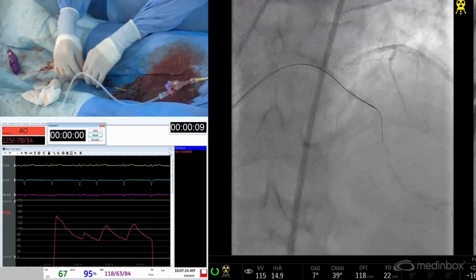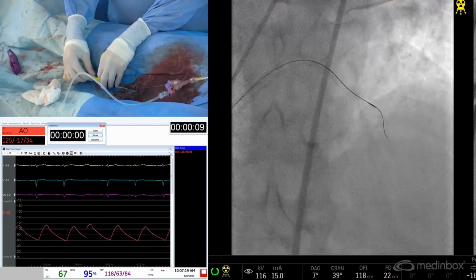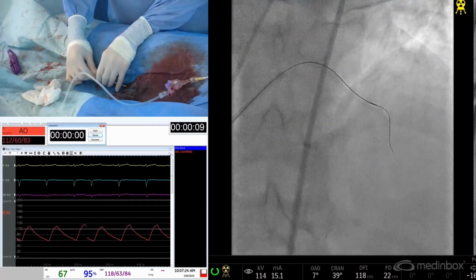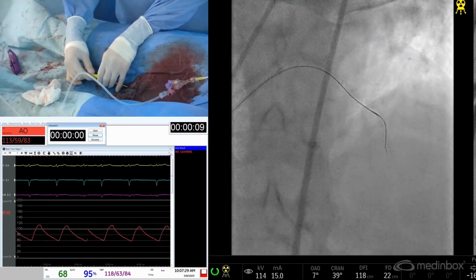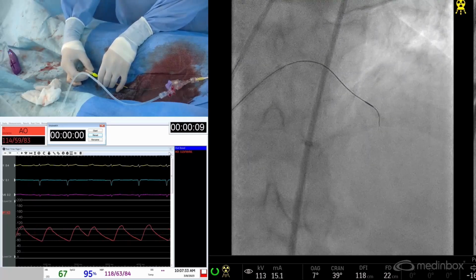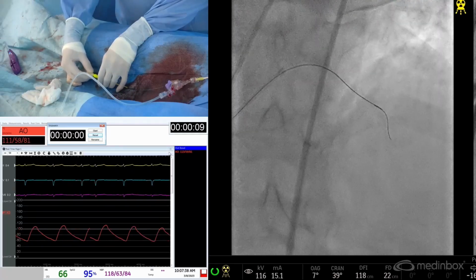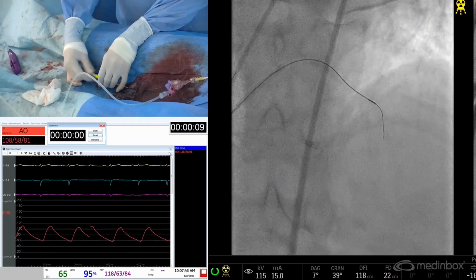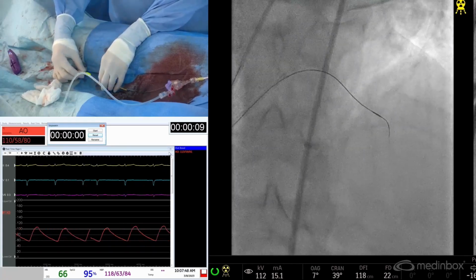a much more severe lesion in the diagonal than we anticipated from the previous angiogram. The lesion that they managed to pass initially has restenosis. As you all know, restenosis rates are much higher with plain old balloon angioplasty, especially in calcified lesions. And I suspect that with the POBA that they did in the diagonal, proximal and mid segment, it left maybe some chronic dissections, so we have run into some more challenges wiring.